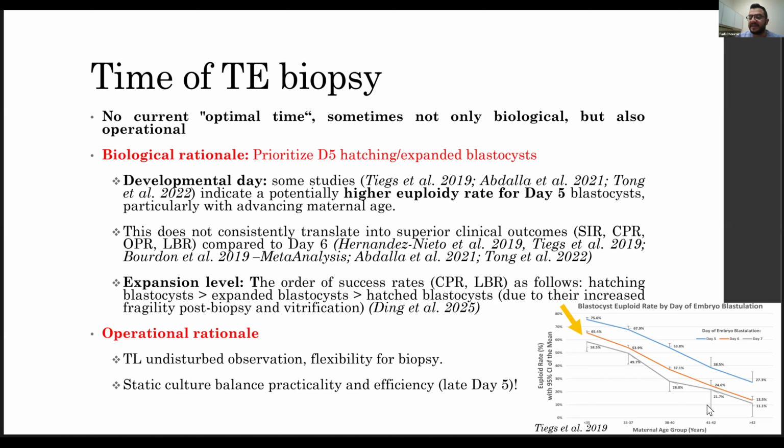Operational rationale: in clinics where you have time-lapse incubation, with undisturbed observation, you have the flexibility to biopsy. But in many clinics around the world where there's no time-lapse, static culture, sometimes you need to balance practicality and efficiency. So it might be pragmatic to biopsy in those places in late day 5, just to avoid disturbing the culture.